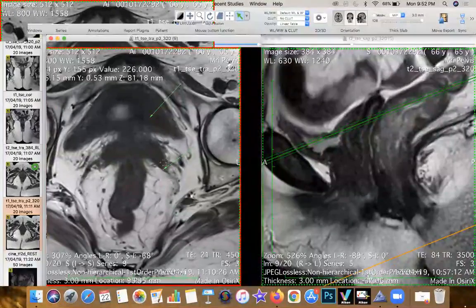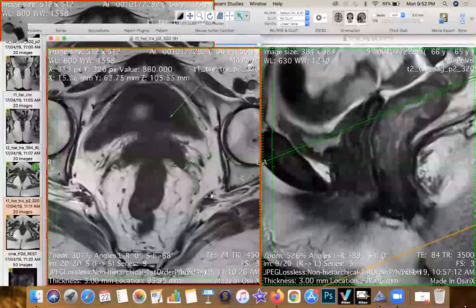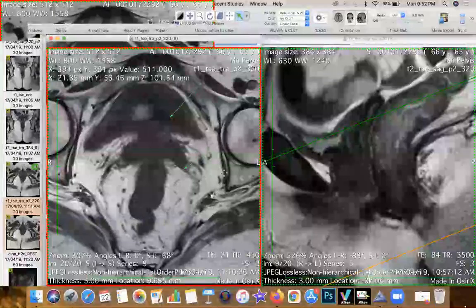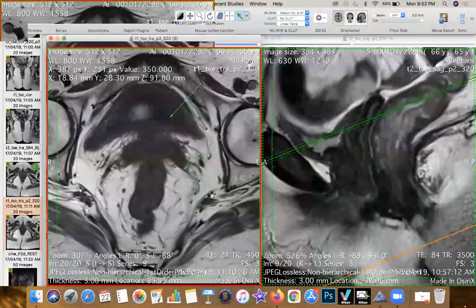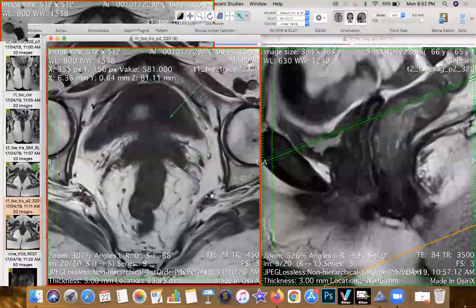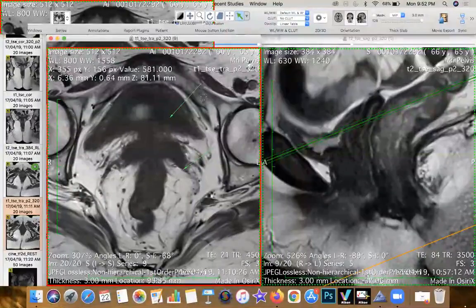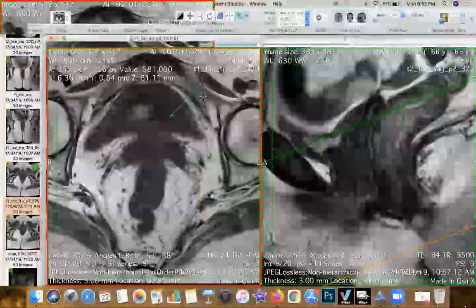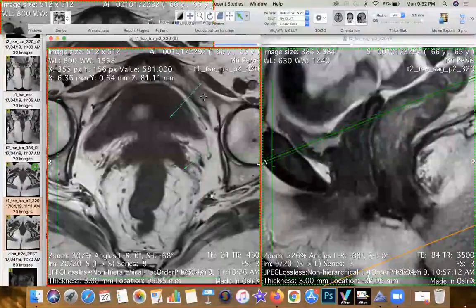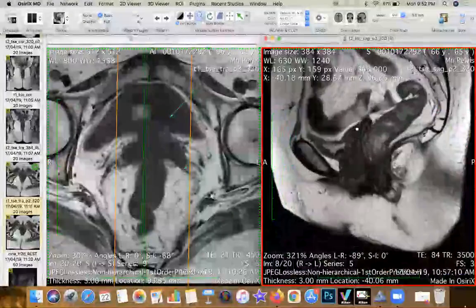So you have this, which is intraperitoneal, this which communicates with the retroperitoneal, and then you have something called the extraperitoneal space, which basically goes along the pelvic side walls, lateral and posterolateral, and arcs rostrally along the undersurface of the parietes, but ventral to the parietal peritoneal reflection. That is called the properitoneal fat. I'll show it to you on the sagittal image, and you can appreciate that very beautifully out here.